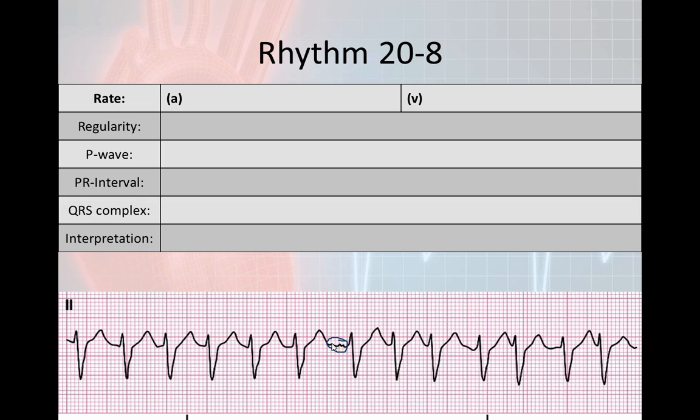I would want to do a 12 lead on this, right off the top of my head, because of the rate by itself. Now, if an atrial fibrillation gets really fast, it's going to look like there are regular QRSs, and it may be regular, and you have to slow it down. You'd still do a 12 lead. But this right here tells me that this is probably an atrial fib. So I would diagnose this as an AFib with rapid ventricular response, RVR. Still do a 12 lead on this, but I would definitely want to find out what's going on underneath.